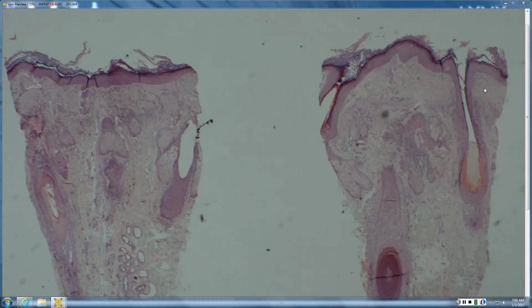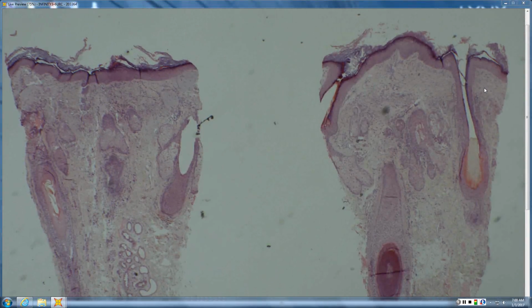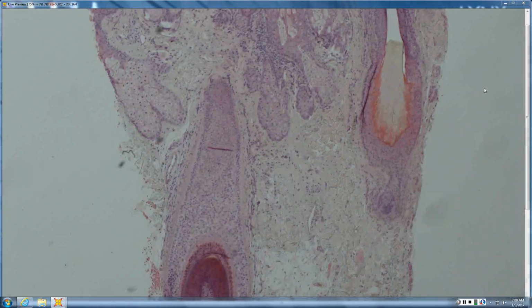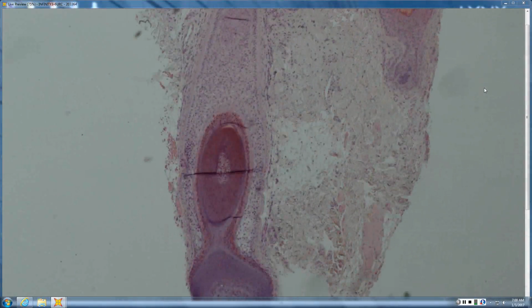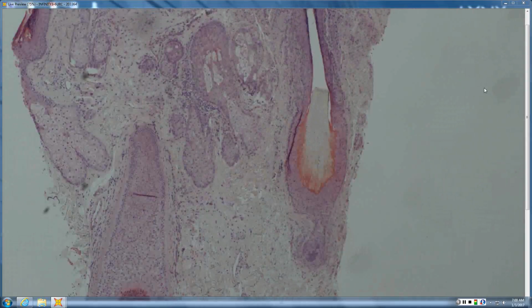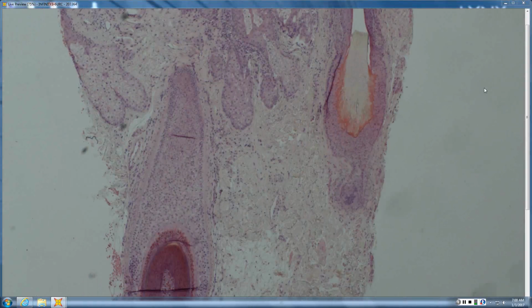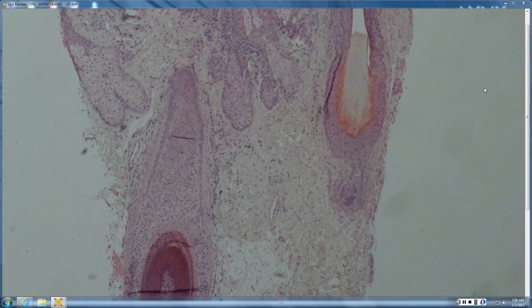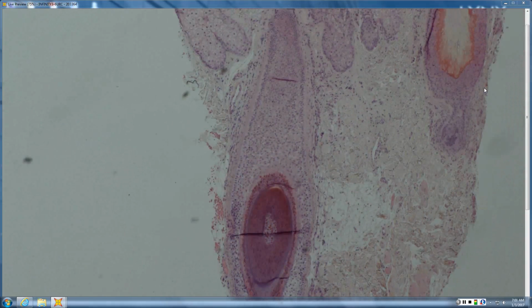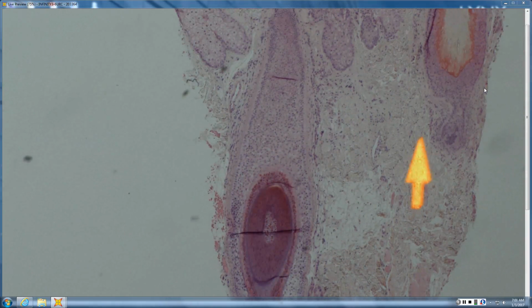So this one is in here in the unknowns really just to demonstrate anagen versus telogen. That's what it's listed as, and it really does do a pretty good job of showing those features. So these are both terminal hairs, because remember there's vellus hairs and terminal hairs, and then there's anagen growing hairs, and then there's catagen and telogen hairs, which you can kind of lump together for the purposes of derm path. And so both of these are terminal hairs, really, these two here.